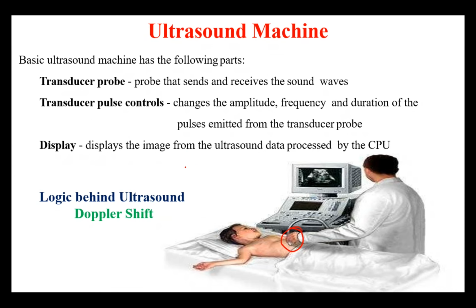I'll show that. So both images, if you see, if you drink water, the same ultrasound, the same transducer, but because of the water, you get a more clear image, right? That's because of the transmission and receiving of the ultrasound signal. Sound signal travels at a good rate in water. If you have water, it's easy to transmit sound, right? So it reaches that particular organ to reflect back. So that's why they ask you to drink water.